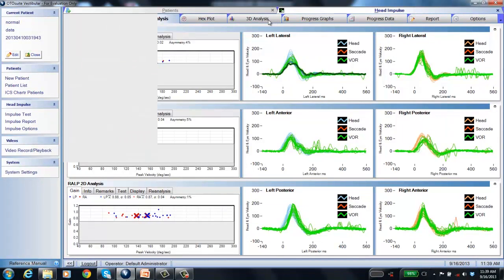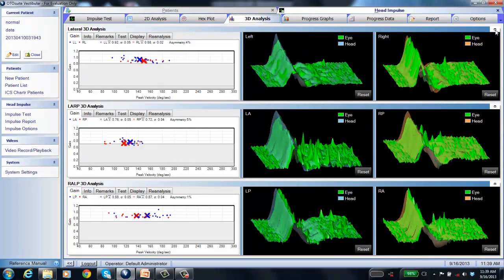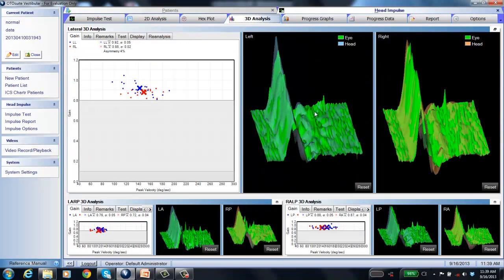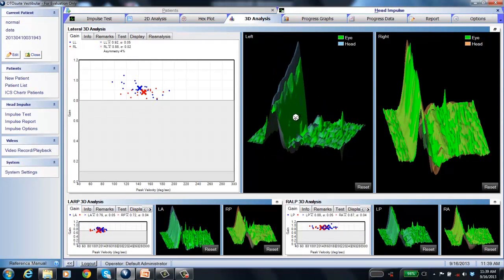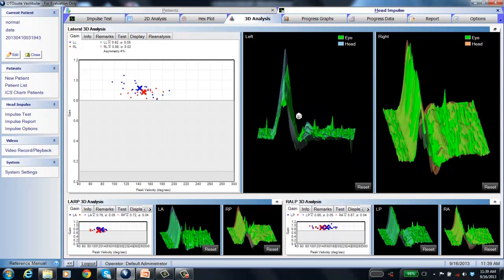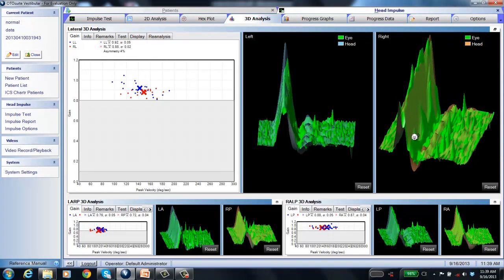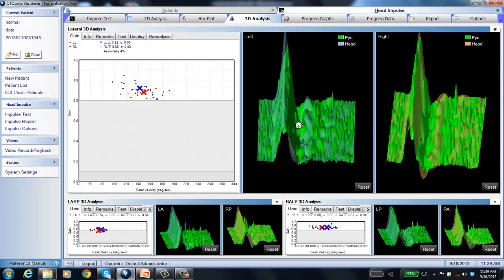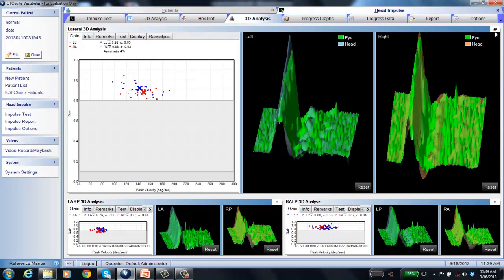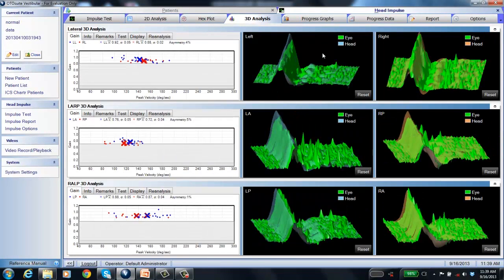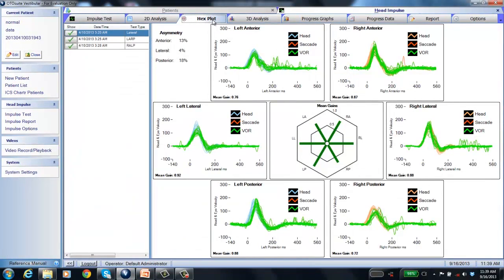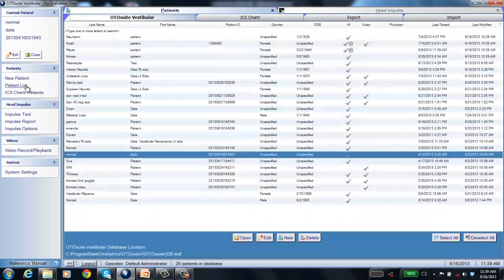In 3D analysis of the normal patient, taking the lateral view and making it large, you can rotate the data. In a normal result, the head and eye traces should be on top of each other — which they are. In the hex plot, introduced in version 2.0, everything is green — everything is within normal limits.